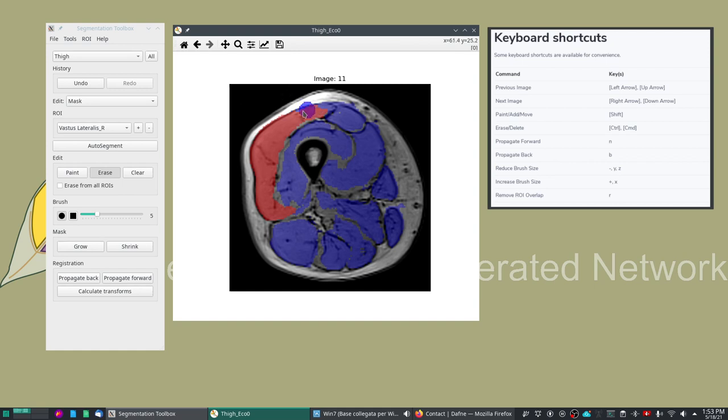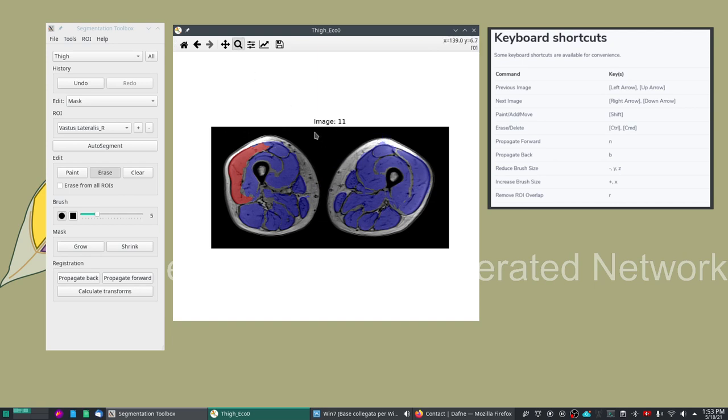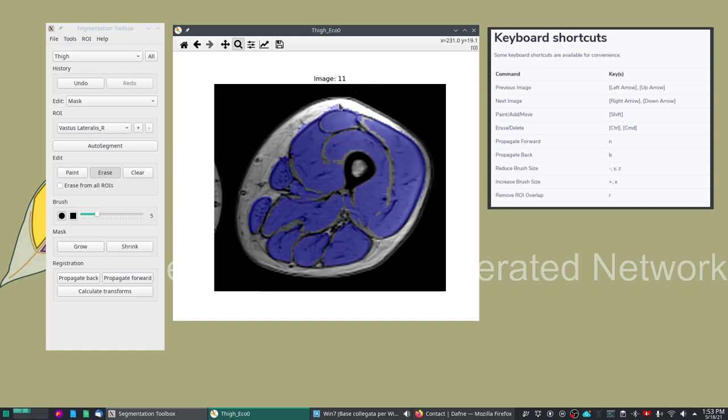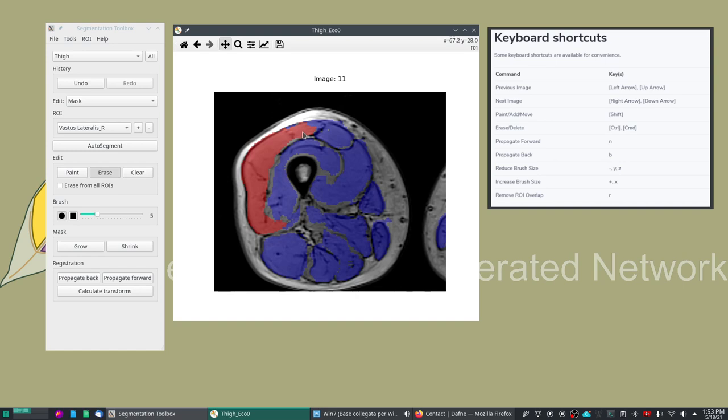You see that the segmentation is already quite good. We can go and see it bilaterally but there are some parts that are still to be optimized. For example, there are some areas here in the fat that shouldn't belong here and we can refine it.